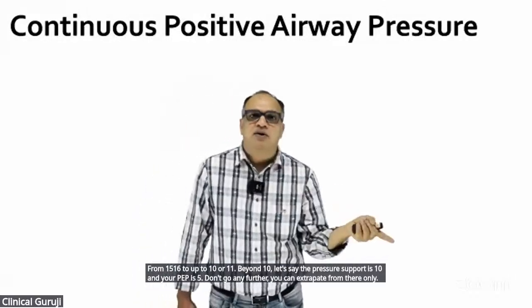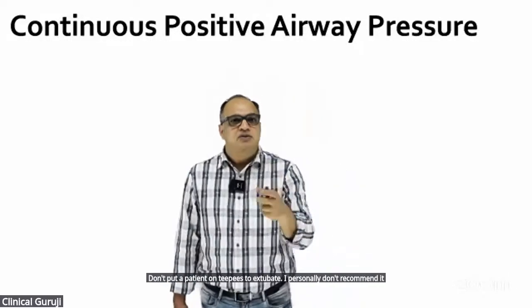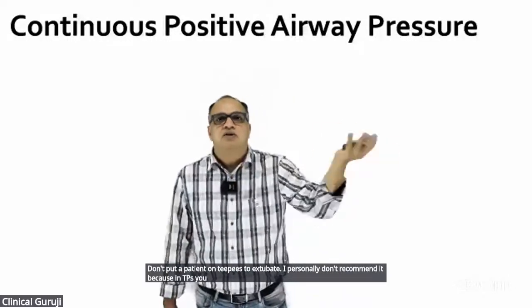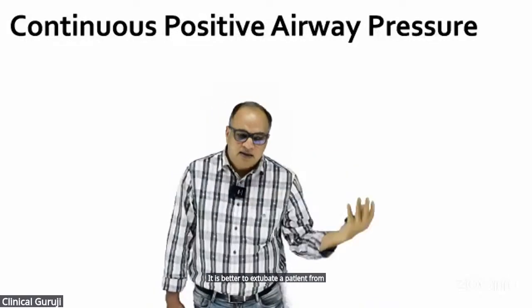Don't put a patient on T-piece to extubate. I personally don't recommend it, because in T-piece you don't see any numbers on the monitor. It is better to extubate a patient from PSV rather than T-piece.